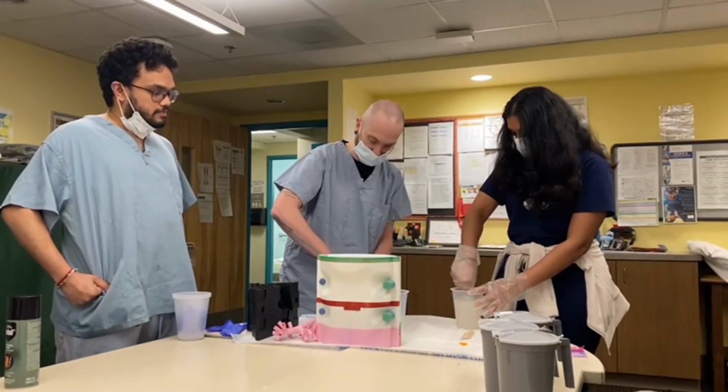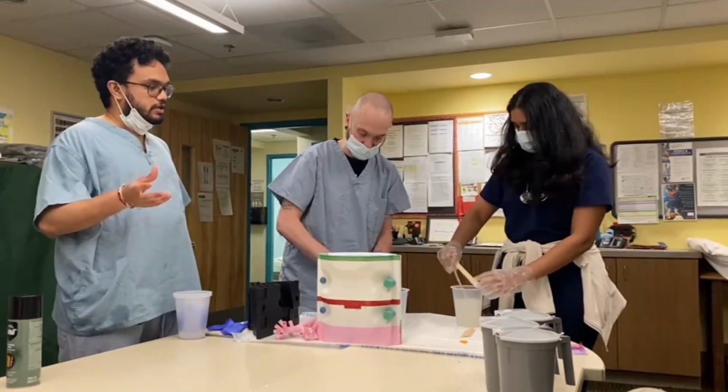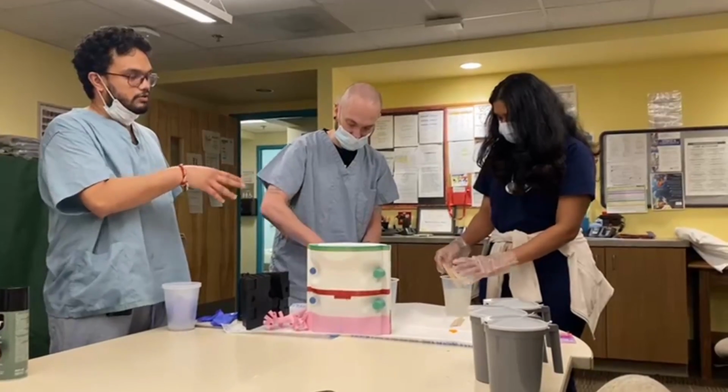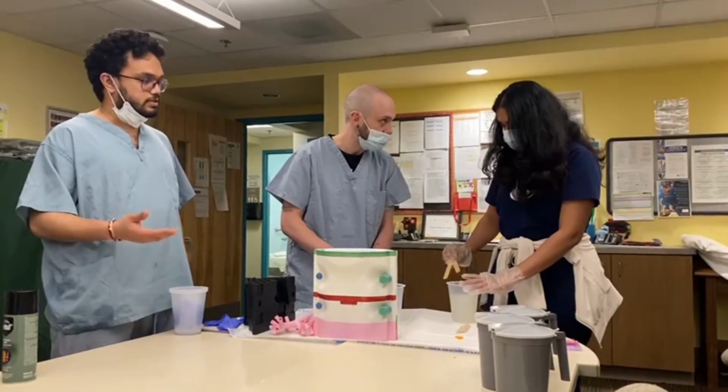Just an added thing, if you're making this model at home, you can always add some color to it. There's specialized colors which you can get to actually color the latex skin color or whatever color you want, which may add some realistic features to it.